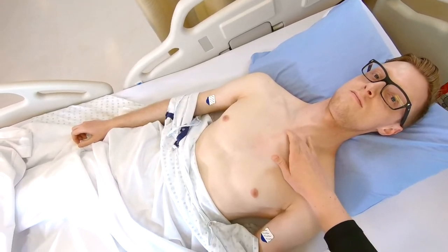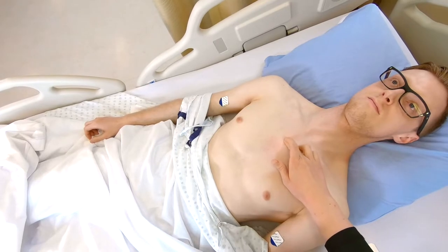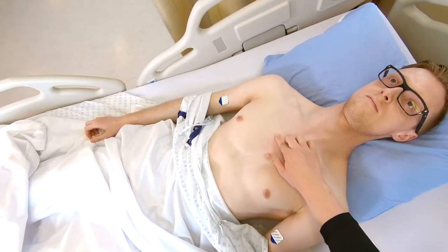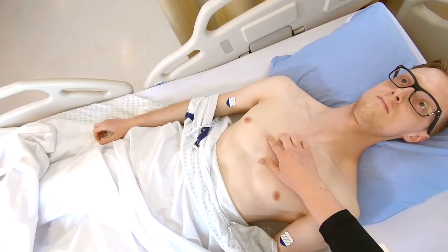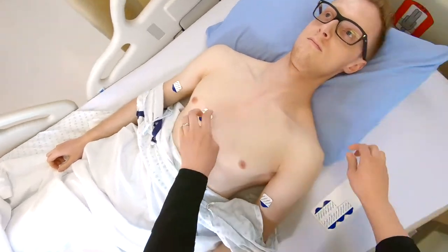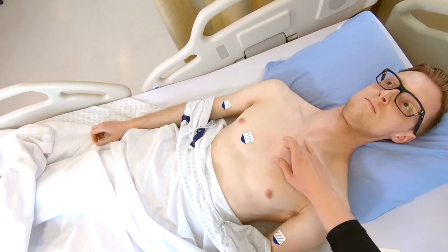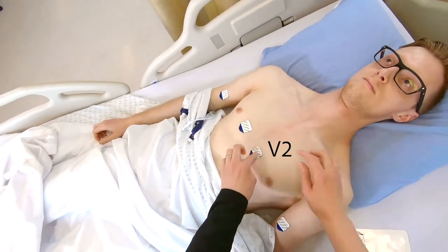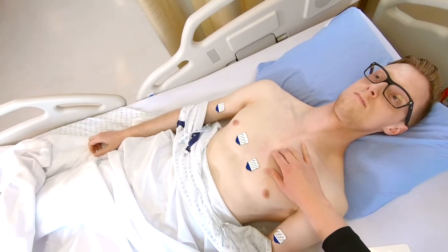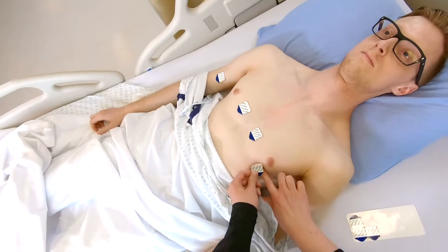This is done by landmarking. First, feel for the sternal notch, identifying the palpable bump beneath it. This is the 2nd intercostal space. Continue palpating down to the 4th intercostal space and place the V1 electrode to the patient's right of the sternum. The V2 electrode is placed at the 4th intercostal space to the left of the sternum. Place the V4 electrode at the left 5th intercostal space, mid-clavicular line.